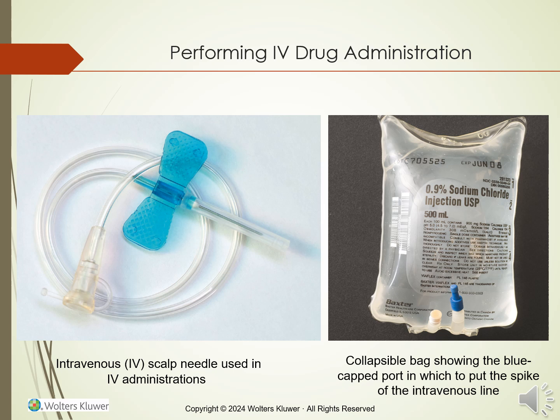For a new bottle, you want to remove the metal cap from the top, but keep the band around the rubber stopper intact to maintain sterility of the substances inside. If you are using a bag, you want to remove the blue stopper on the front while keeping the area sterile and avoid touching it. Then you would use a spike to spike the bag that will connect tubing, so the solution in the bag will go from the tubing into the IV that has been placed.